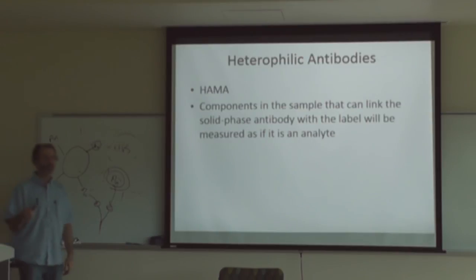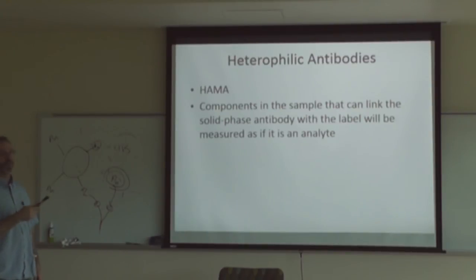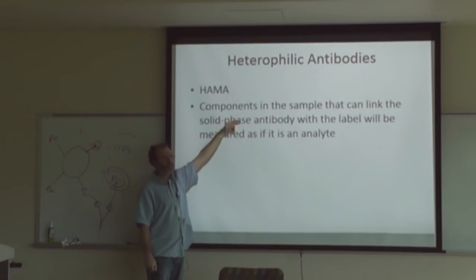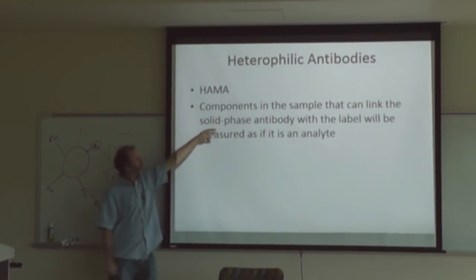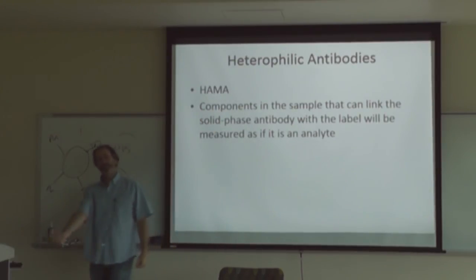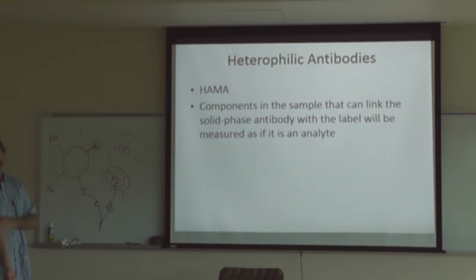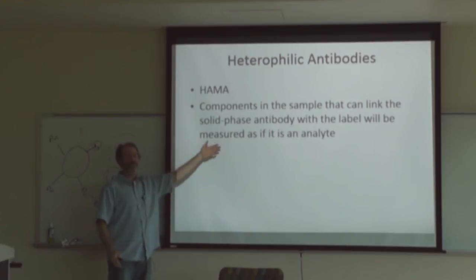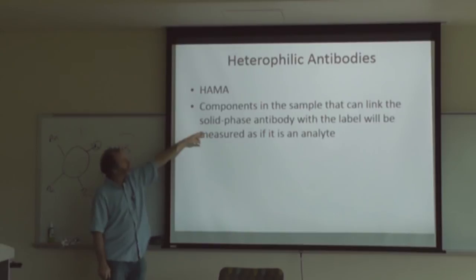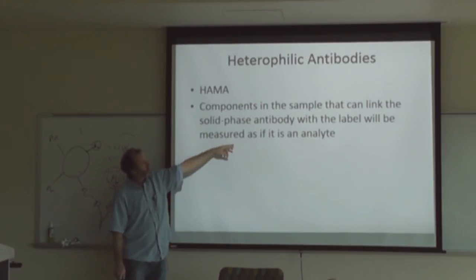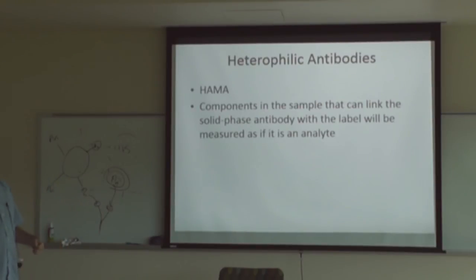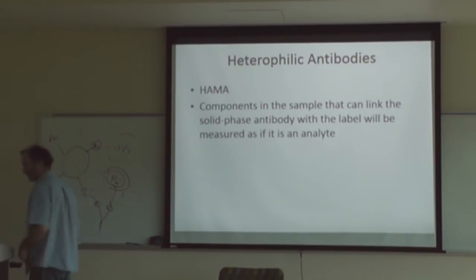Heterophilic antibodies can interfere with immunoassays. One of the most common are HAMAs — human anti-mouse antibodies. If a patient has been treated with a monoclonal antibody therapy, they may develop antibodies against mouse antibodies. These anti-mouse antibodies in the patient's serum will react with the monoclonal antibodies used in many tests, causing interference. Components in the sample that can link the solid-phase antibody with the label will be measured as if they are analyte, so you should review patient history to assess the likelihood of HAMA interference.